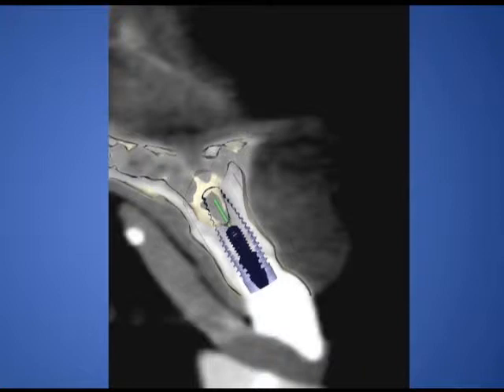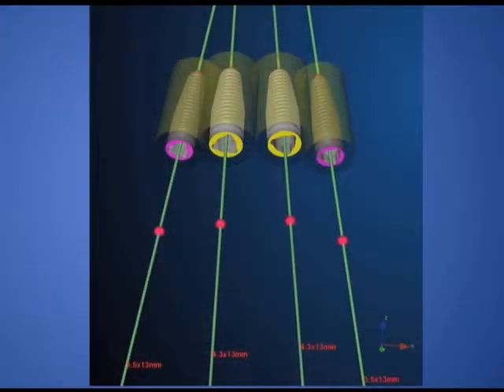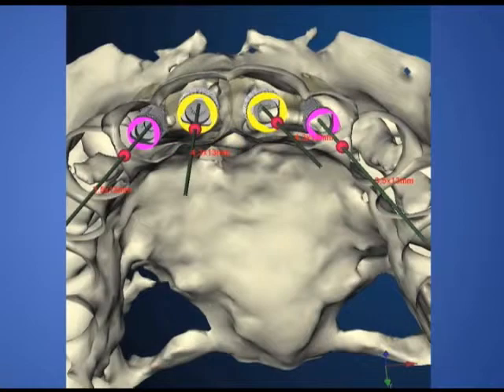So we made three-dimensional models, and we determined whether or not we could place implants in the anterior premaxilla. And we found that we could successfully place the implants, allowing ideal separation between the implants and nice depth placement of the dental implants. We would place 3.5 millimeter diameter implants in the lateral incisor areas and 4.3 millimeter diameter implants in the 2 central regions.